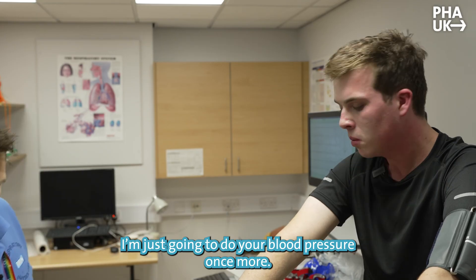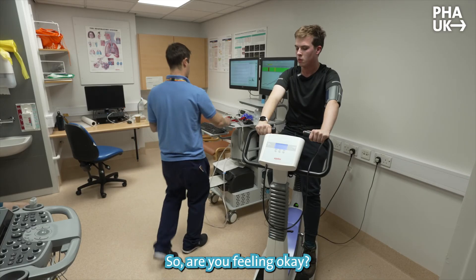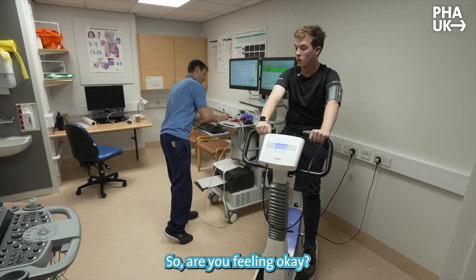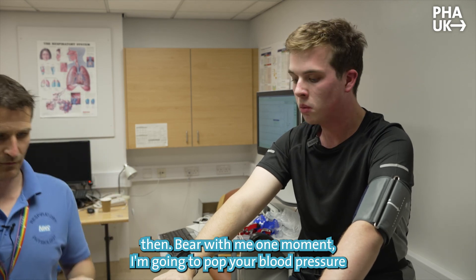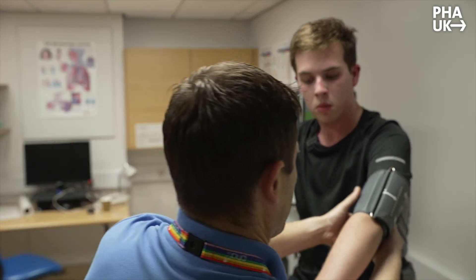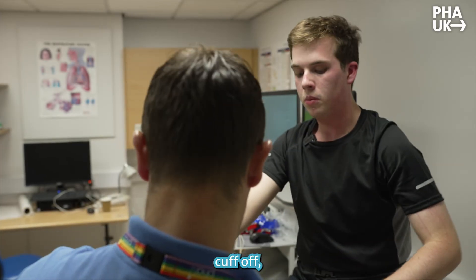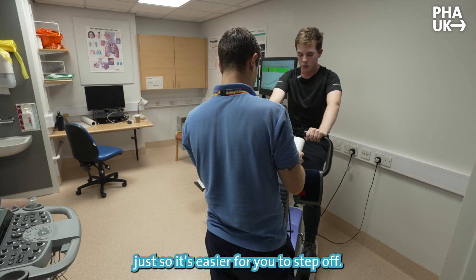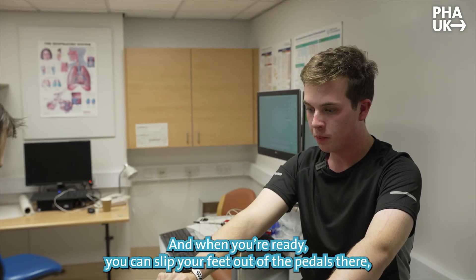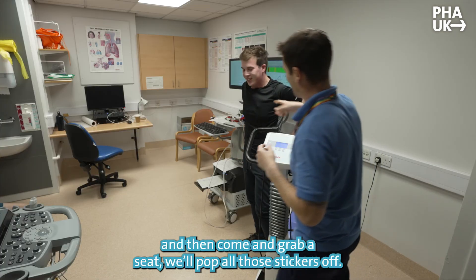The heart rate's coming down nicely. We're just going to do your blood pressure once more. Feeling okay? Excellent. I'm going to stop the test there then. I'm going to pop your blood pressure cuff off, and just hold on while I lower the seat down a little bit so it's easy for you to step off. When you're ready, you can slip your feet out of the pedals and come and grab a seat. We'll pop all those stickers off.